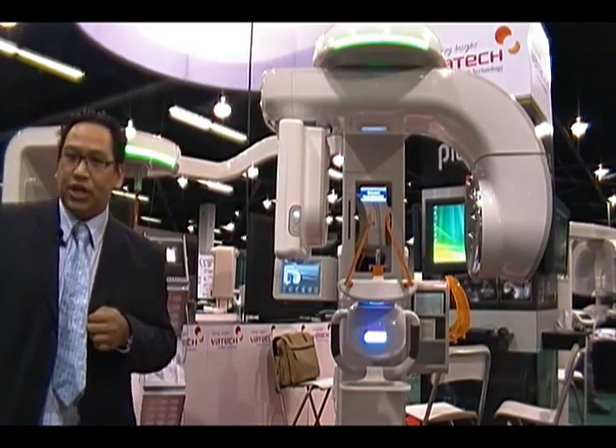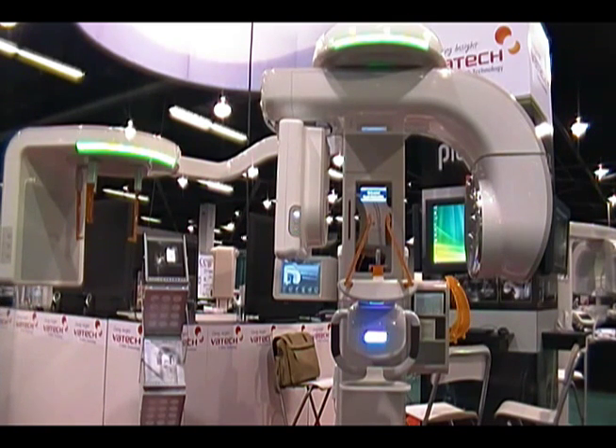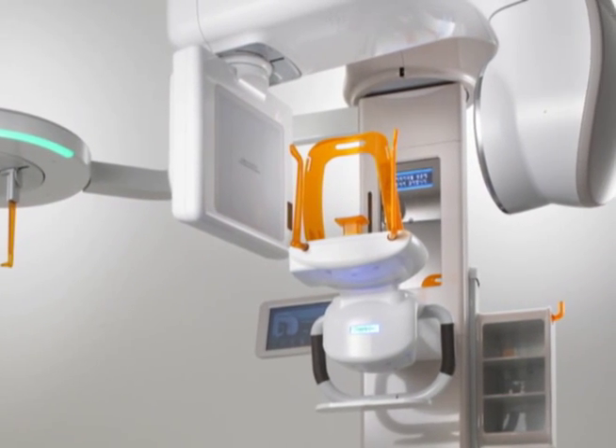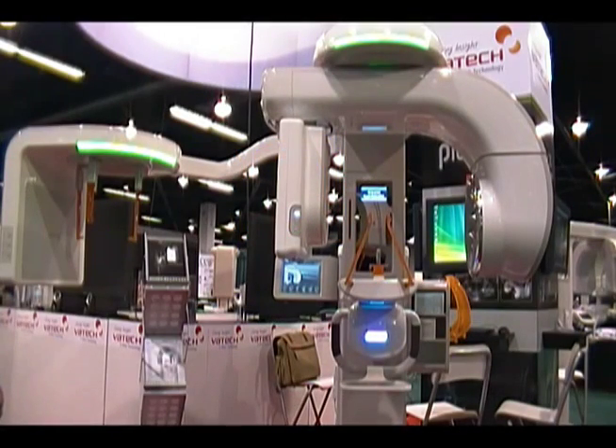The device you see behind me is called the PAX Reve 3D. This is one of the most amazing units in the industry. What's unique about this device is that we have three different types of imaging modality: a digital pan, digital CT, and of course a digital ceph. What's unique about it is we're using the best imaging sensor for every modality, so there's no compromises on image quality.